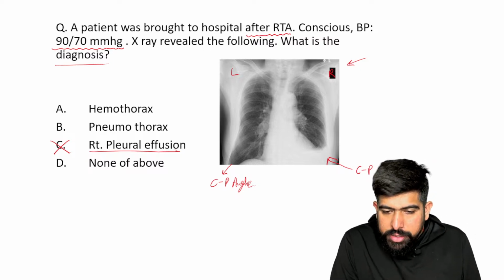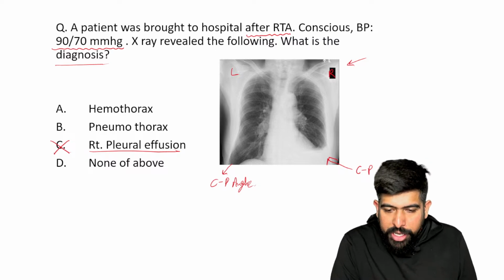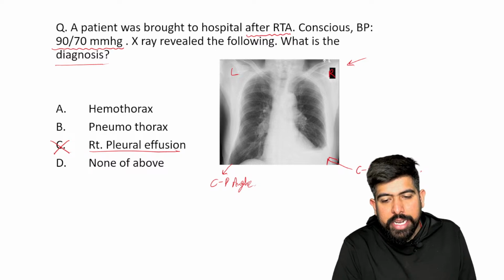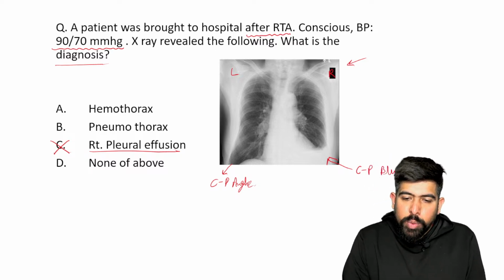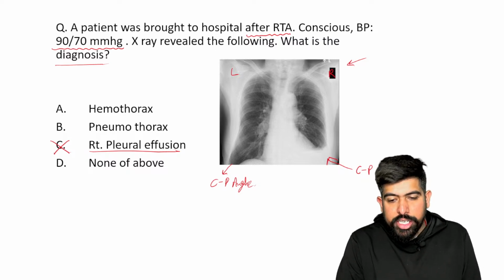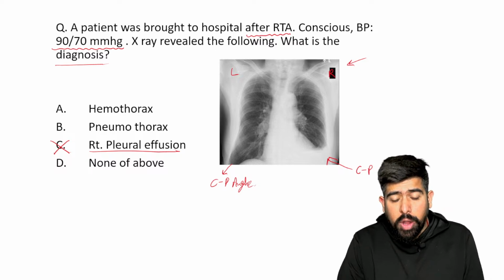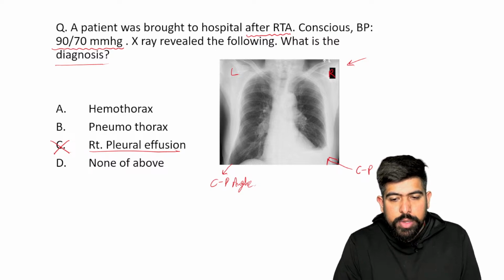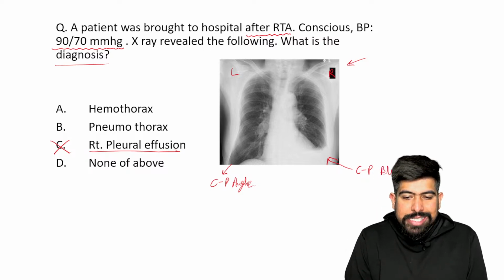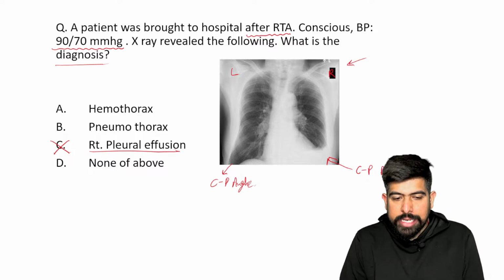Yes, right-sided, I already agree with you, doctor. It could be effusion because blunting is seen on the right side. But please let me know, in pleural effusion, would the blood pressure decrease, and would there be a need for an RTA? The options are given to you. Please remember, the clinical history given is RTA, road traffic accident. Yes, blunting on the right side is seen, I agree with you. But let me know, is it a possibility?